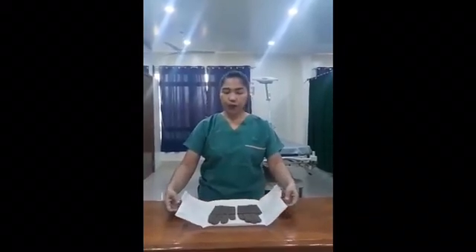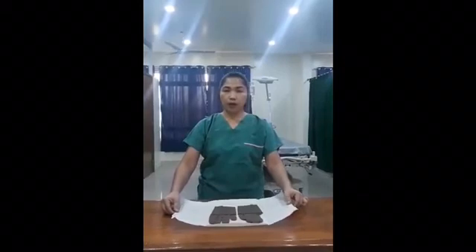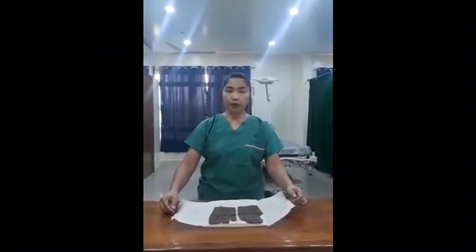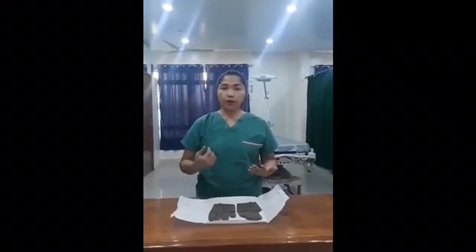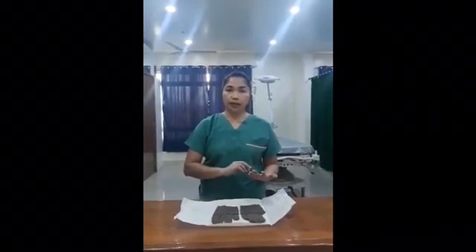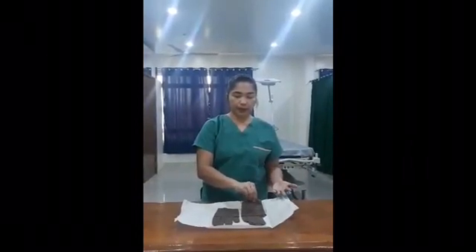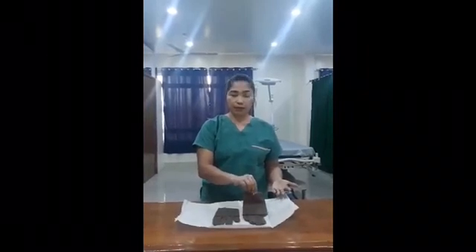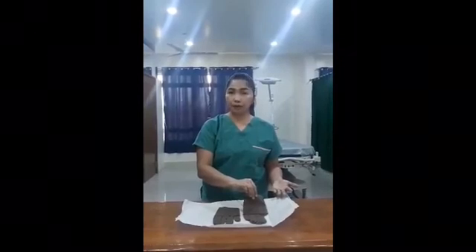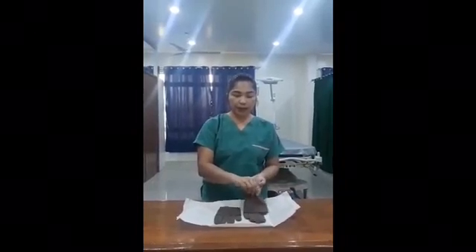We are now opening the sterile top. The first thing is you are going to use your non-dominant hand — you have to start with your non-dominant hand. Mine is the left hand. Why am I holding this? Because this is the inner portion of the glove. I can touch this one because later it's going to touch with your skin. And then slip your hand through that.